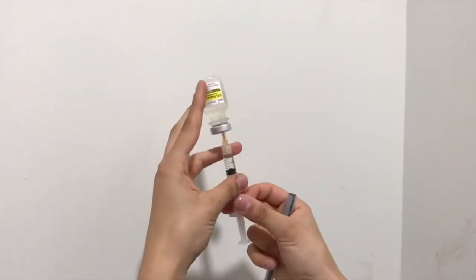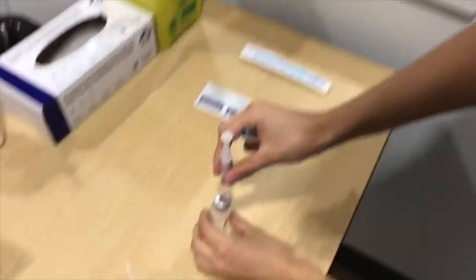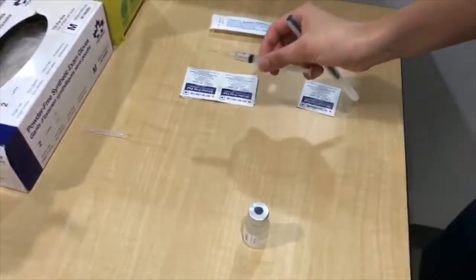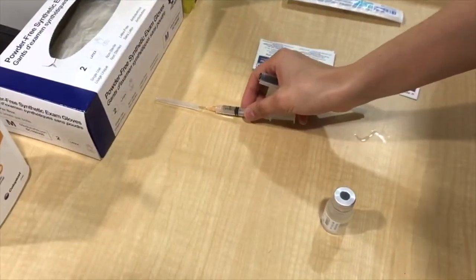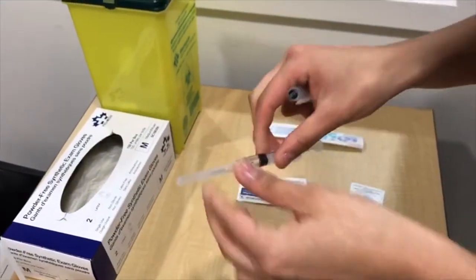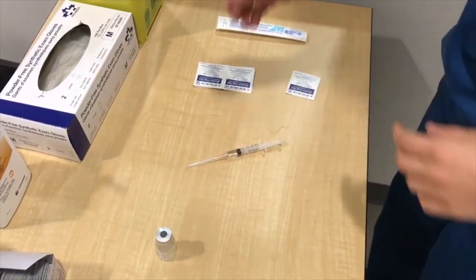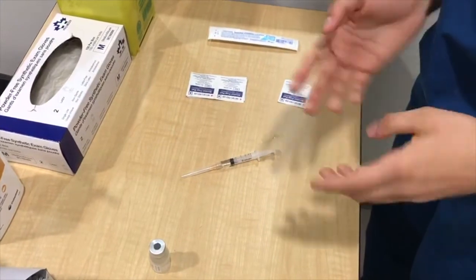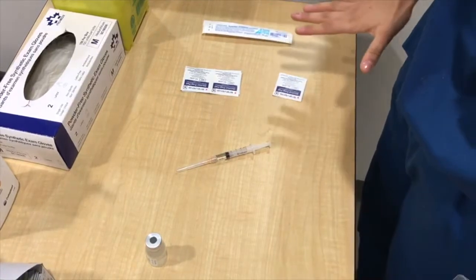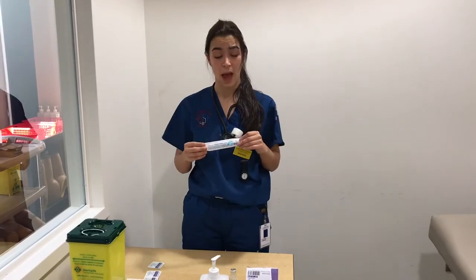And what I'm going to do is I'm going to take the needle out of this medication vial on the table and then recap it. It's important when you're recapping that you do it against a hard surface so that you're not at risk for any needle poke injuries. It's also important that at this stage I would label the needle with the patient's name and other information about the medication that I will be giving, because I am going to be transferring it from this location to the bedside.